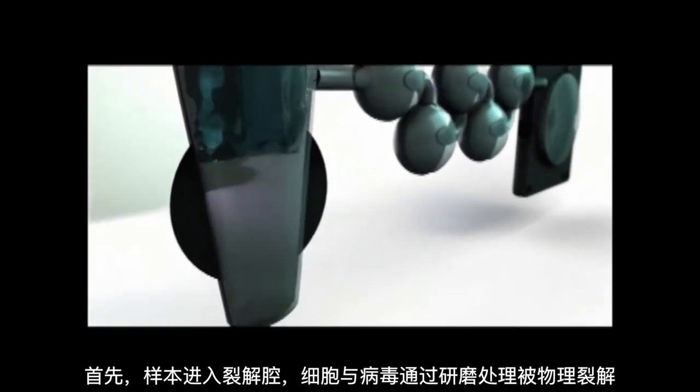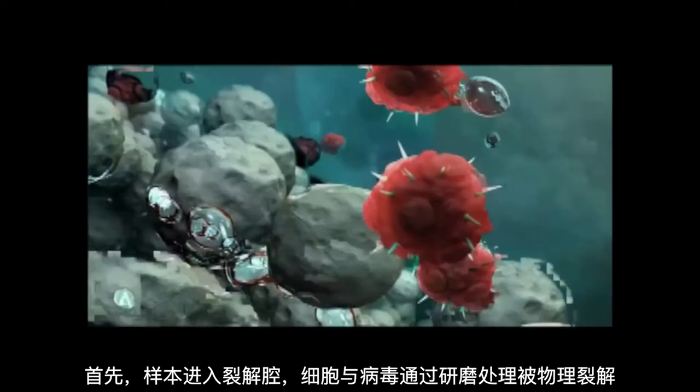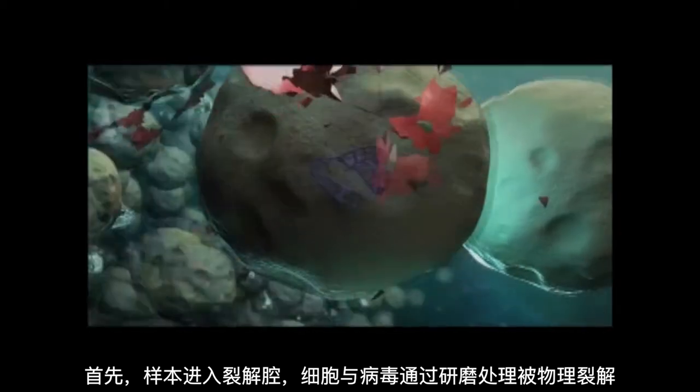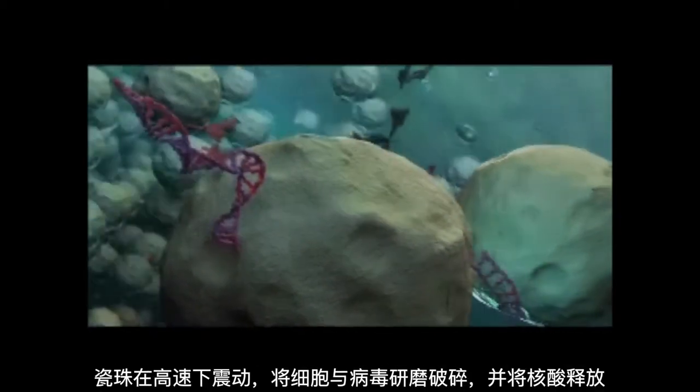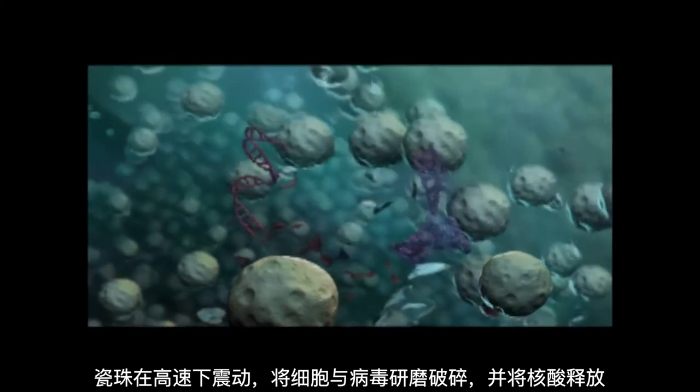First, the sample is moved into the lysis chamber where the FilmArray physically lyses any cells and viruses through a process called bead beating. Ceramic beads are agitated at high speed to break open cells and viruses and release the nucleic acids.